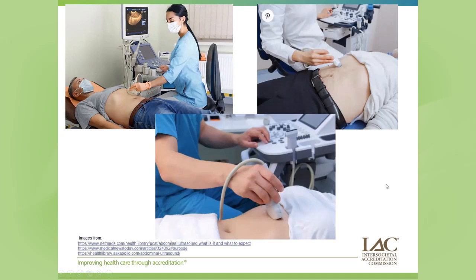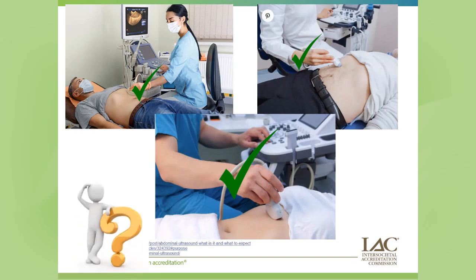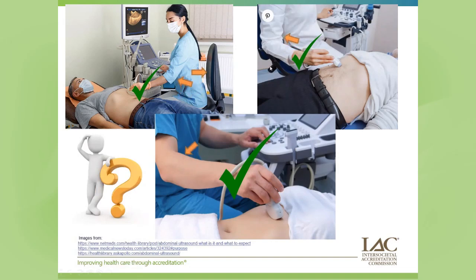I took these images here from several different modalities and wanted to point out, hey, this is some great wrist positioning, so that's good, but what else can we look at in this image? Well, is this sonographer close enough to the chair where their back is supported, and could the system move closer to them so that they're more supported and everything's in more of a neutral position? Or can they get a little bit closer because the shoulder is kind of coming out there?